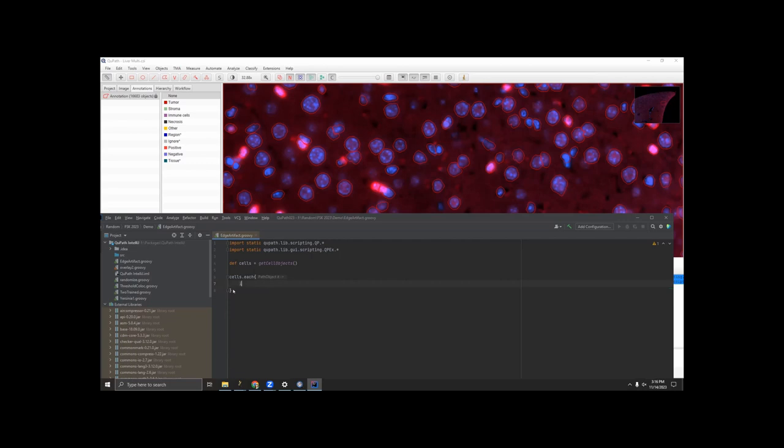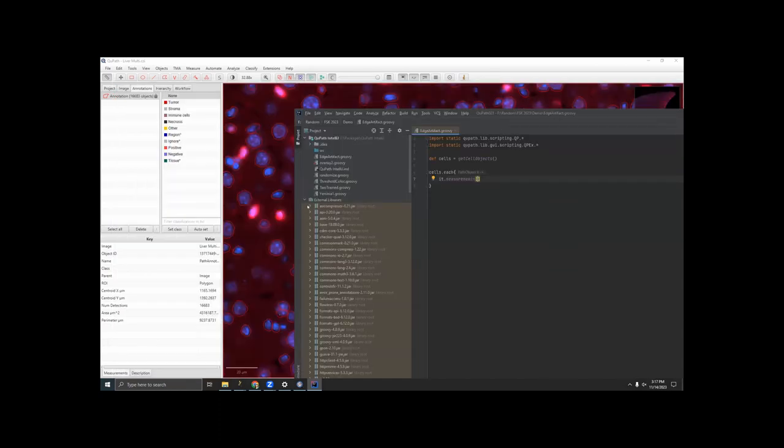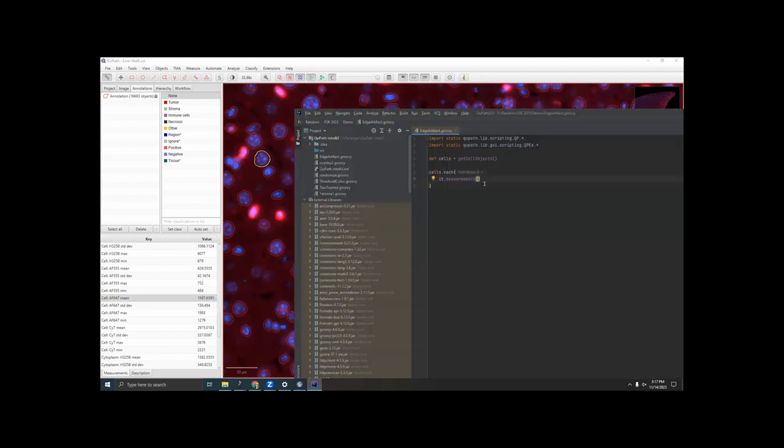So we're working with the cell measurements. And if you just type it dot, IntelliJ automatically suggests that you want measurements. And you could go through all of the different functions that are available for this object, but basically, yes, I want measurements. And I want to subtract the cell mean minus the background mean. And the way you use this measurements list is just by calling it with the string name inside brackets. And the easiest way to get the string name is just copy paste. So I'm going to pick one cell, go down to Cell AF647 mean, because I'm looking at that channel, and just right click, copy and paste.